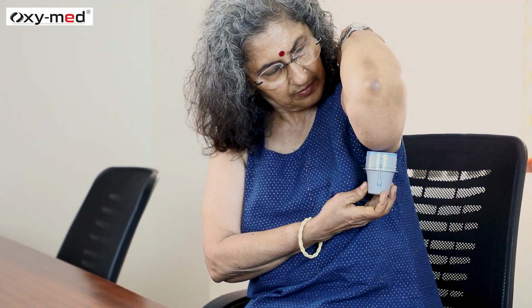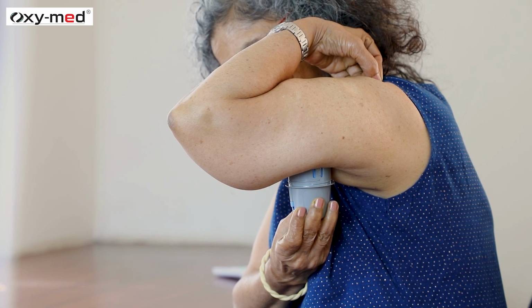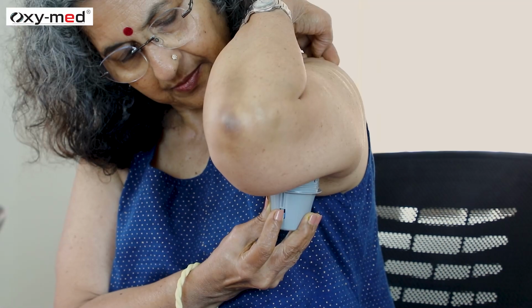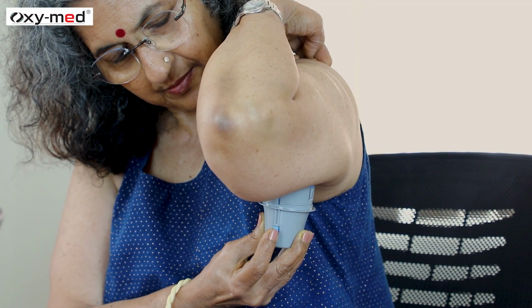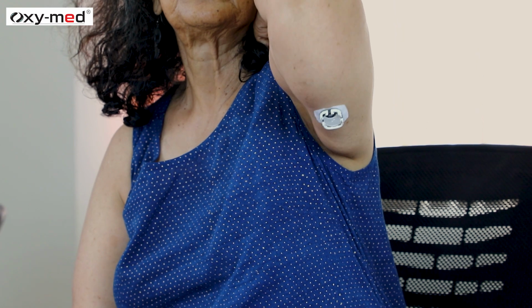Place the applicator on the desired location. Press the applicator firmly against the arm until the side button reaches the top limit. Press the side button to launch the sensor. Make sure the sensor is secured. Remove the applicator after you have successfully inserted the sensor, leaving the sensor on your body.